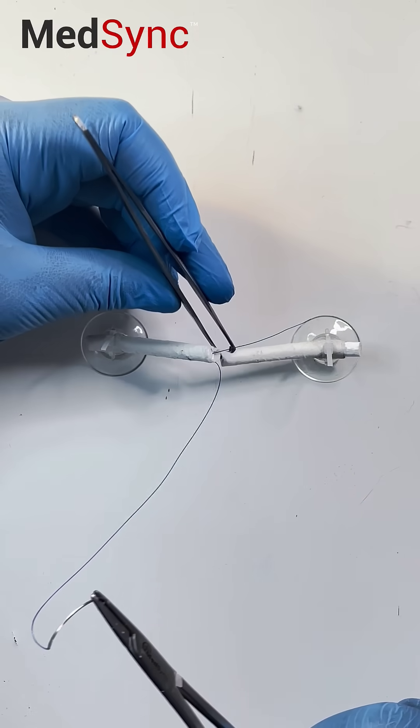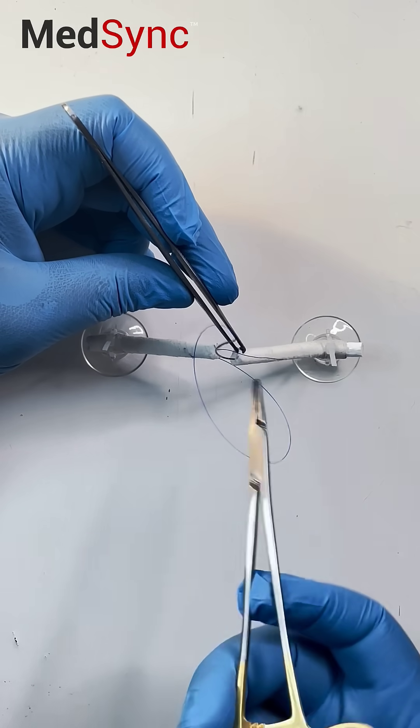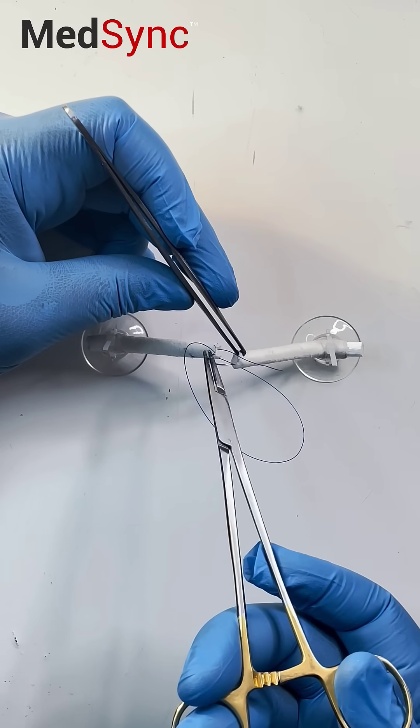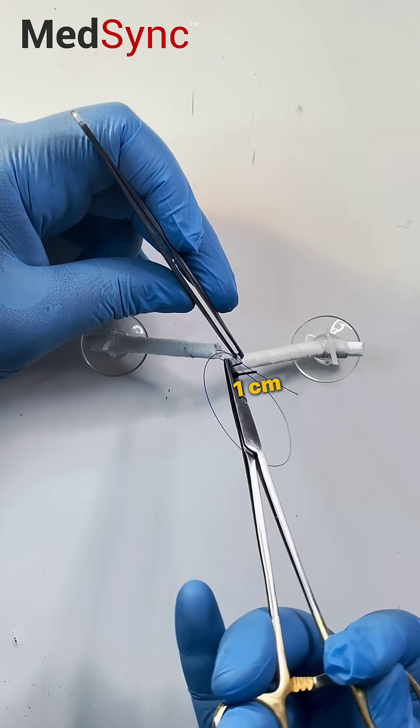We need to complete the other half. You enter longitudinally one centimeter distance from the end of the cut tendon.